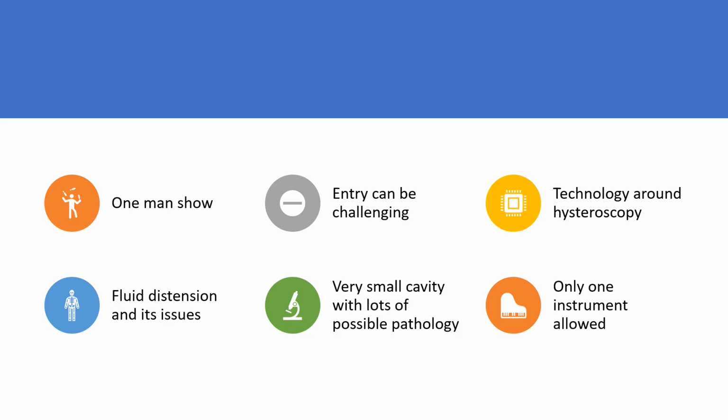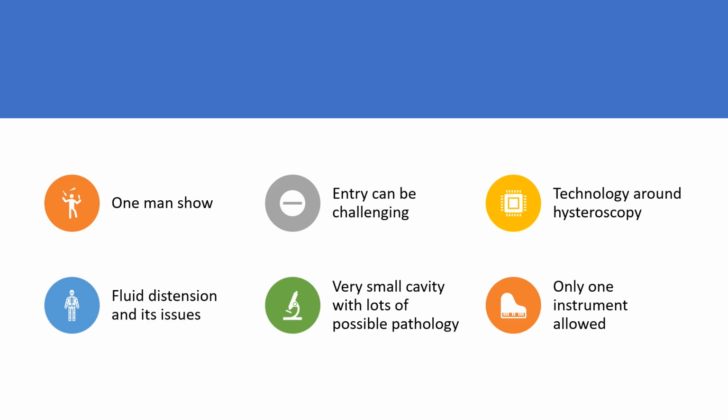Two, entry can be challenging. So you have to understand how am I supposed to take care of these challenging entry scenarios? You need to understand the technology about hysteroscopy very well, because it has a very narrow safety margin. I've told you it's dangerous. So if you're not careful, you can easily complicate matters there.